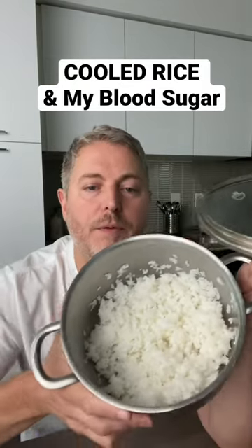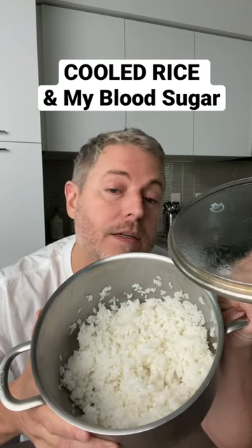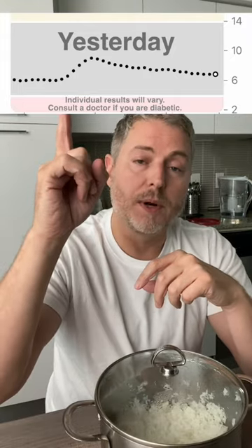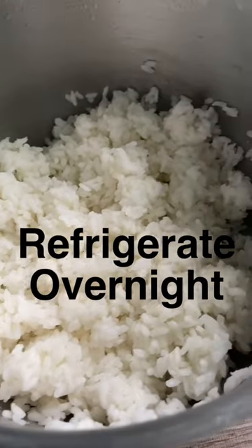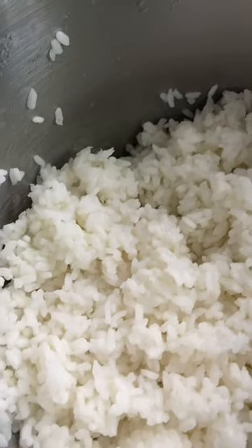I've chilled this rice overnight in the refrigerator and I want to test it on my glucose monitor to see if it's any different from freshly cooked rice. Yesterday I cooked up a batch of white rice and tested it on my glucose monitor — you can see the results here. Then I took the leftover rice and put it in the fridge overnight. The idea is to increase the resistant starch so it doesn't affect your blood sugar as much.